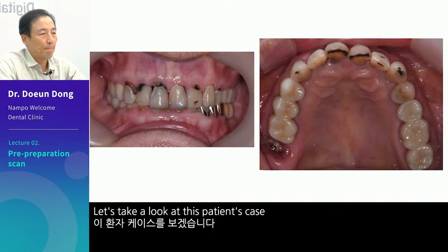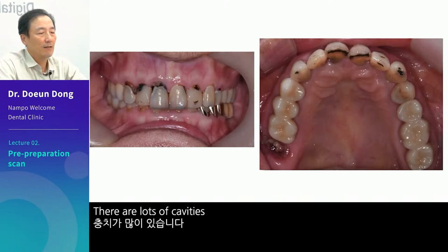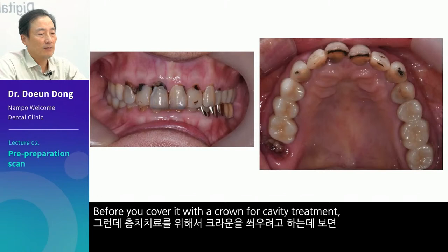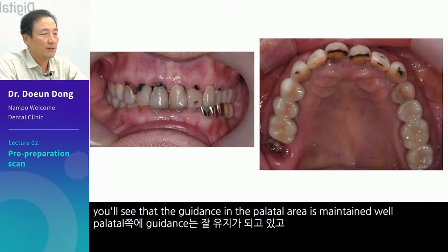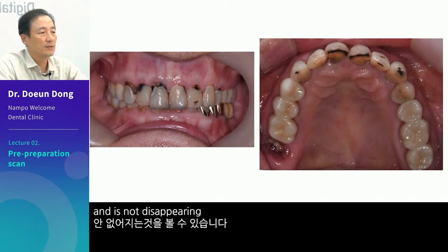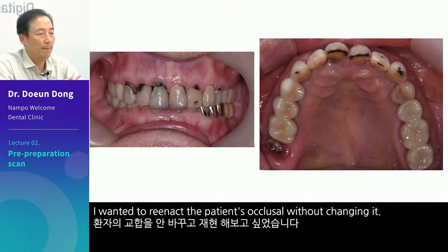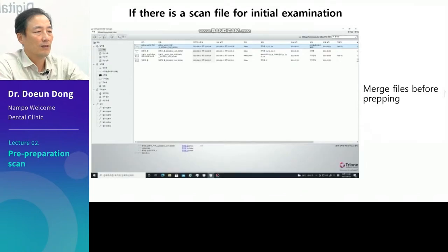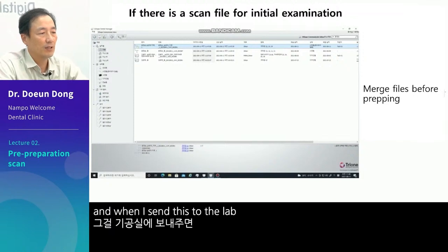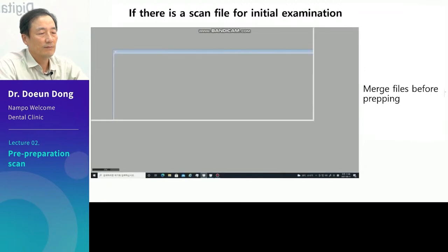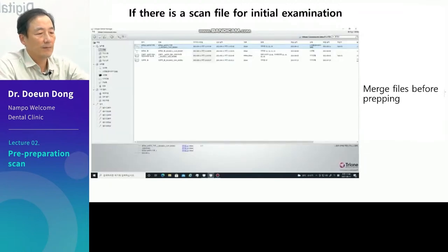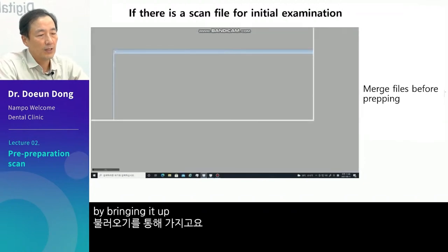Let's take a look at this patient's case. This case has not been closed yet — there are lots of cavities. Before you cover it with a crown for cavity treatment, you will see that the guidance in the palatal area is maintained well and is not disappearing. I wanted to reenact the patient's occlusal without changing it. I scanned the file before prepping and when I send this to the lab, they can merge the files by bringing it up.